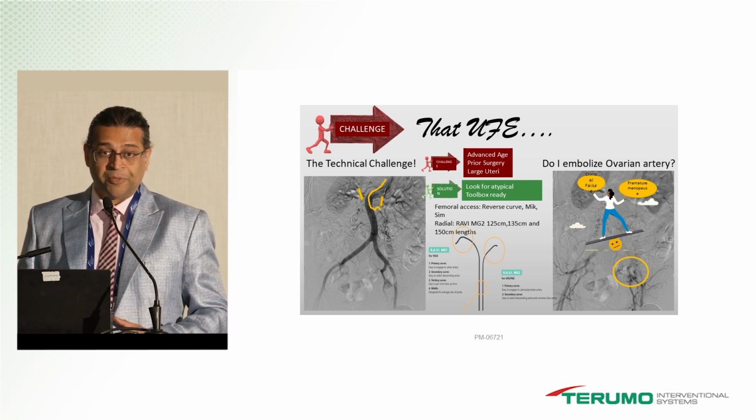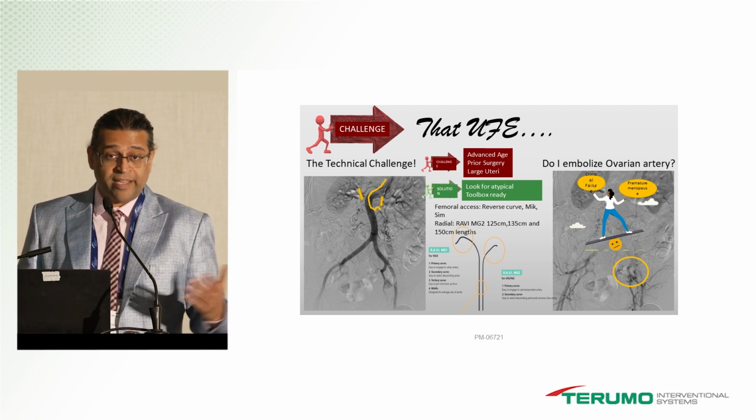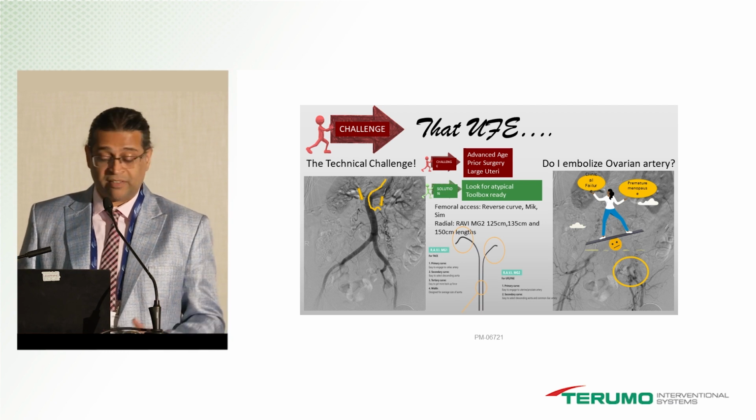I've taken the radial approach, okay? I've embolized the right side, and should I shift to femoral? Yeah, I can. But data has shown that we don't need to shift anymore. There is zero conversion rate from radial to femoral because of this.